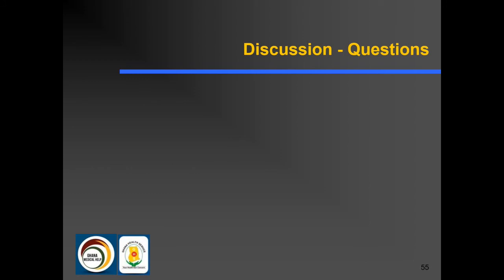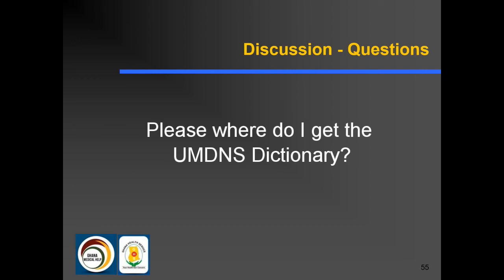So let's go to another question, Bill, is, please, where do I get the UMDNS dictionary? Okay. The UMDNS dictionary is available in a number of different formats. It's basically either a PDF file, which is like a big book with many thousands of devices. But it's also available as a spreadsheet, an Excel spreadsheet. And that's what we're going to be using to actually import a subset of the dictionary into your database. But both of those files are freely available.